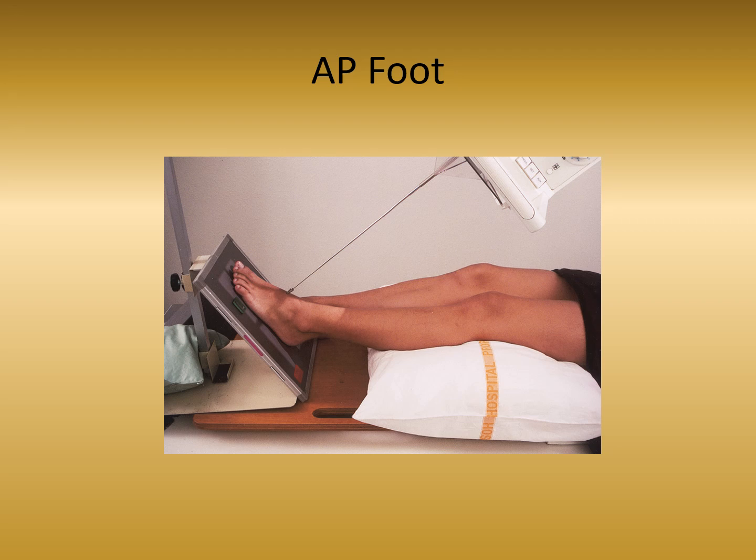Now, the positioning of the toes is the same, the AP toe positioning for trauma. That one also would be keeping the central ray perpendicular to the IR, placing the IR along the long axis of the foot against the plantar surface of the foot.